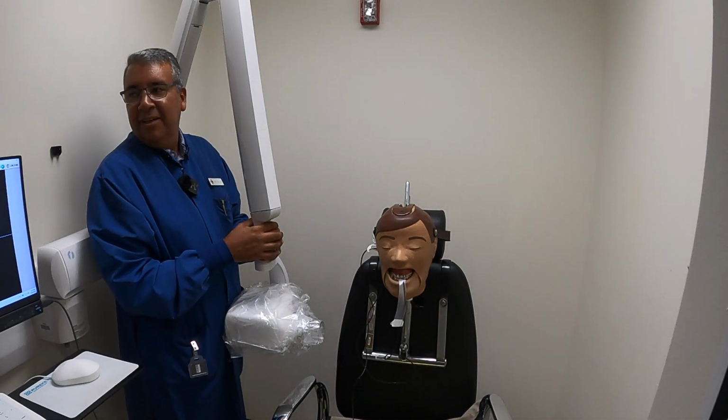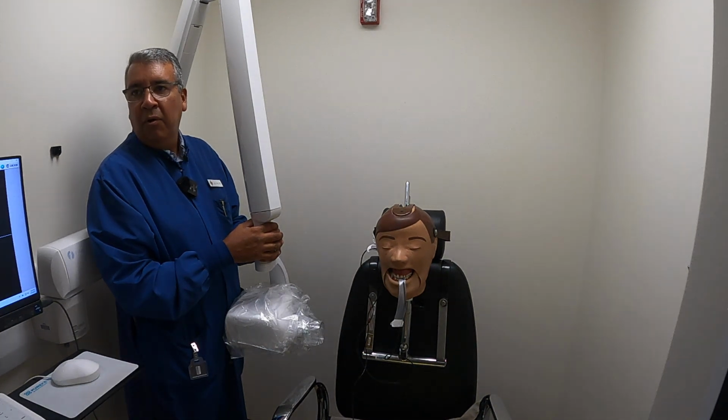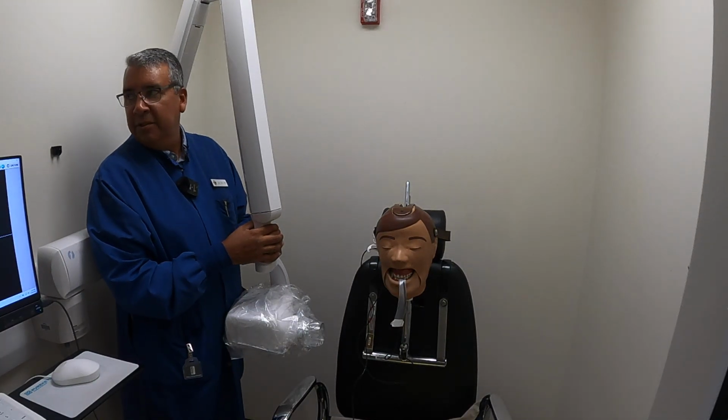Ready? Our horizontal angle is based off of the horizontal direction of the teeth we are trying to take. Whether that's premolar or molar, doesn't change.